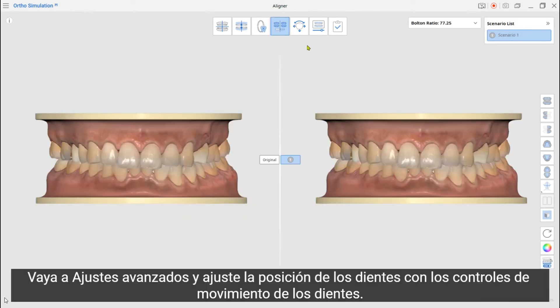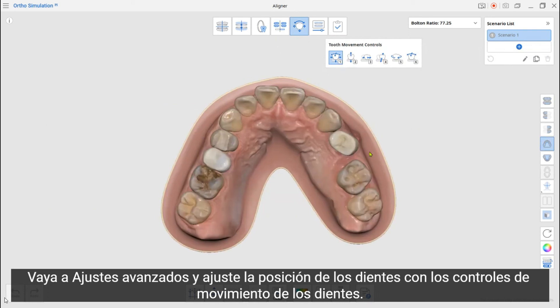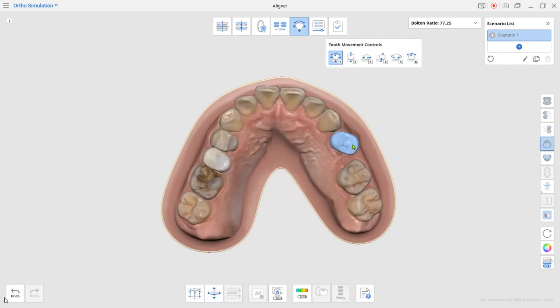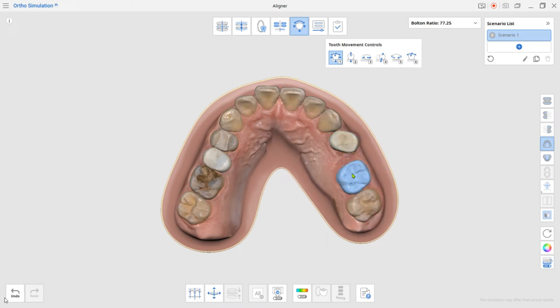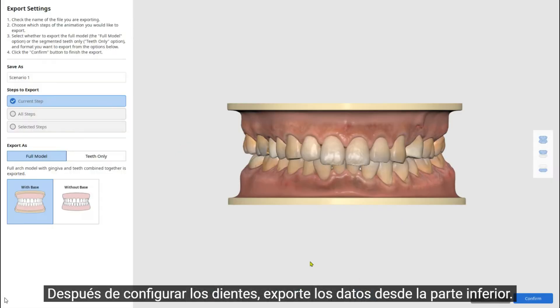Go to Advanced Adjustments and adjust the teeth position with the Tooth Movement controls. After setting up the teeth, export the data from the bottom.